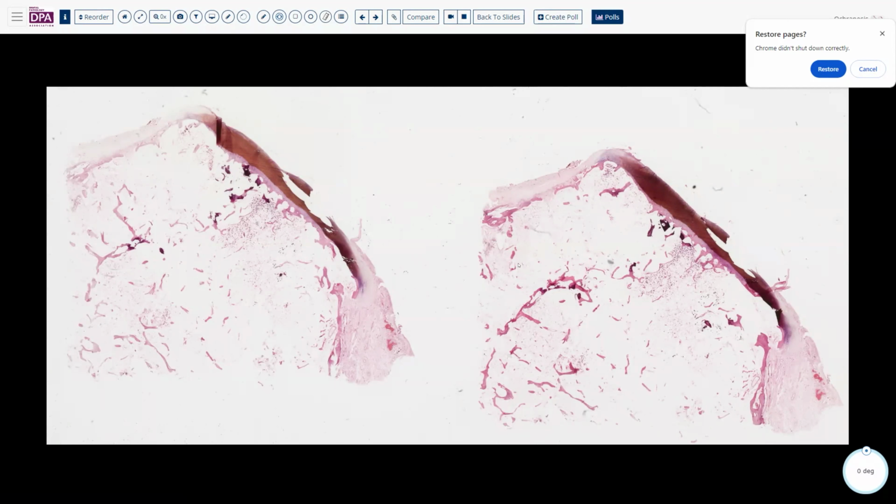As you can see here at low magnification, there is very pronounced osteopenia, so a very great degree of bone loss with just very few remaining spicules that don't look all that solid. But there's something else here that we don't usually see, and as you can probably surmise, we have a funny discoloration to the articular cartilage.